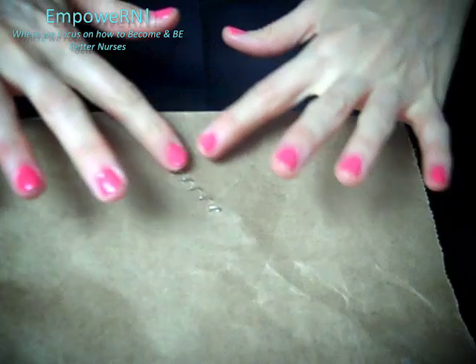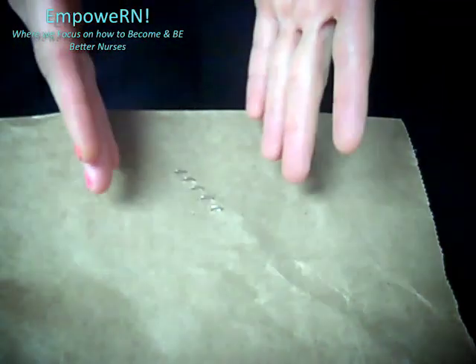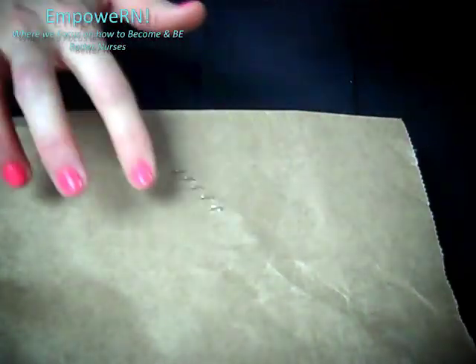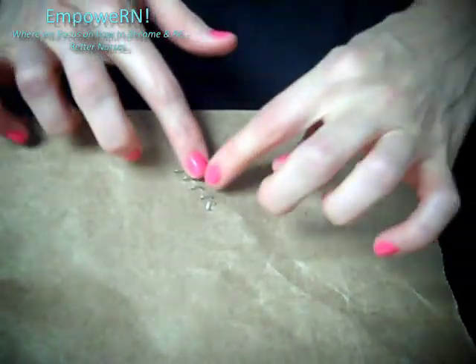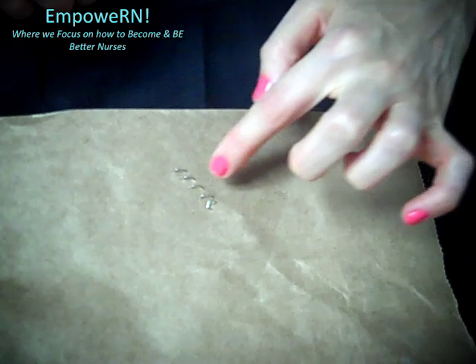Now let's get into the skill and I'm going to show you how to remove surgical staples. I put them on a paper bag so that you can see the staples a little bit better. Before you start, you want to look at the wound and make sure there's not a lot of redness — there should be just maybe some slight pinkness — and most of the skin should already be together. You also want to measure the wound, taking good measurements probably in centimeters, and then count the amount of staples.